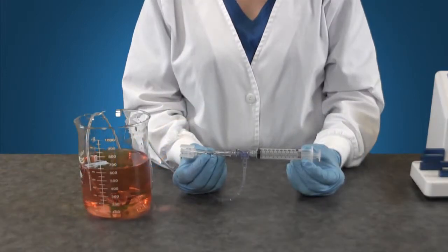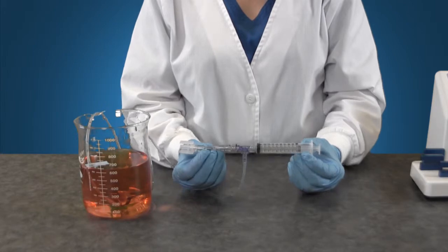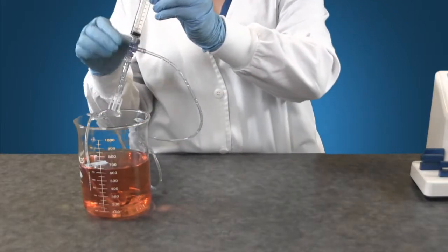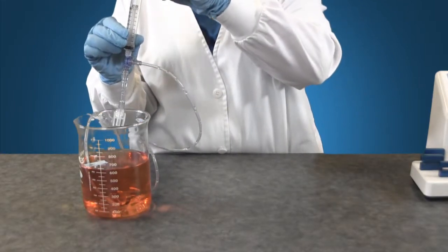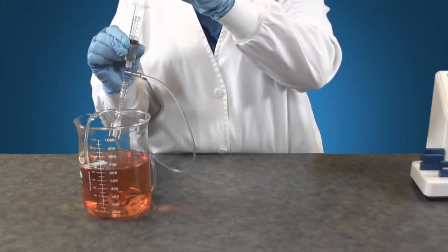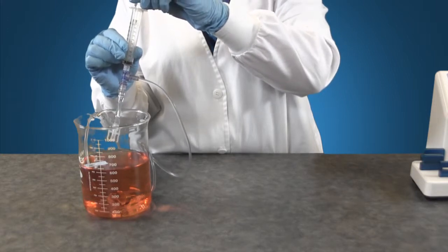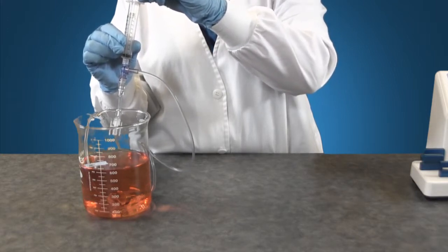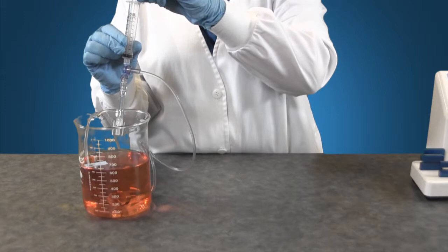With your tubing set assembled you are now ready to prime the set. Point the adapter end downwards into the beaker. Pull back on the syringe plunger to draw solution into the barrel. Press the syringe plunger to empty the solution back into the container. Repeat this process until the length of tubing is filled with solution.